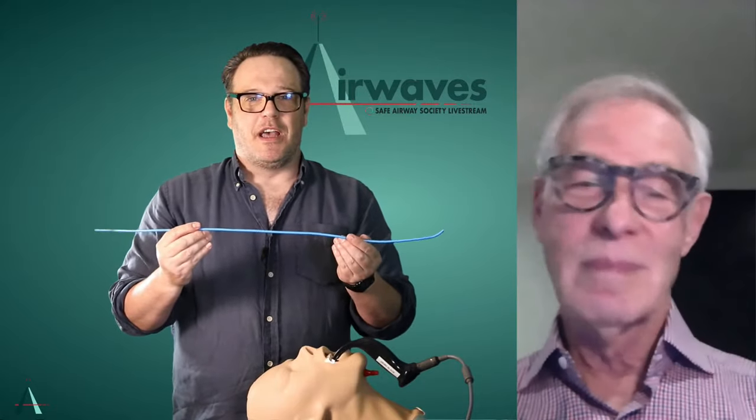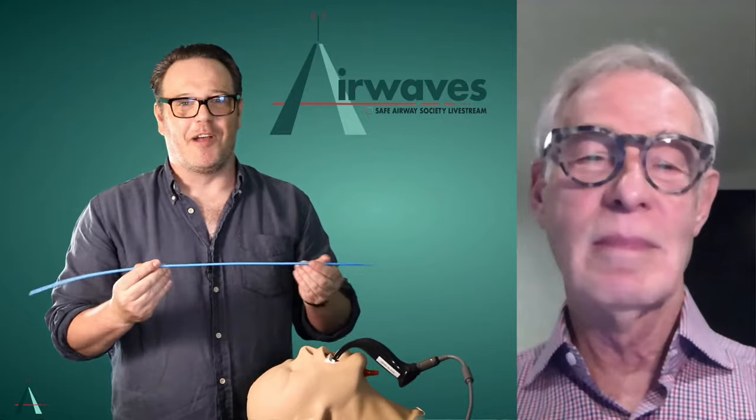To me, what you want is a technique that works in the most difficult airway, not only in the most straightforward difficult airway. What are your thoughts on using a straight bougie for a hyperangulated blade? I personally don't honestly feel the need for it. The number of times that I get a grade three view is probably less than 0.5%, if I could fit the laryngoscope in the patient's mouth. So I would prefer to advance the endotracheal tube under visual control rather than to railroad an endotracheal tube over an introducer.